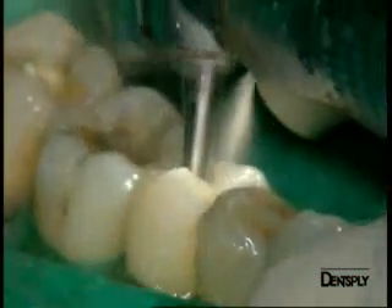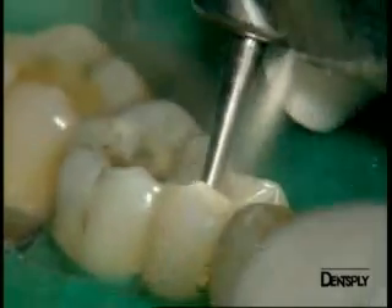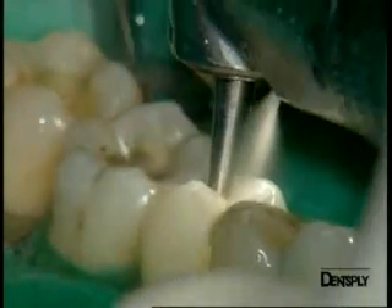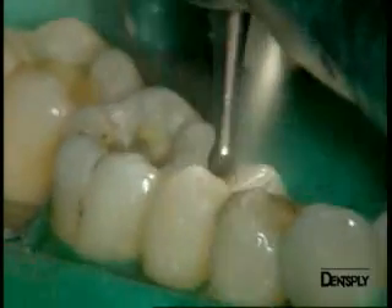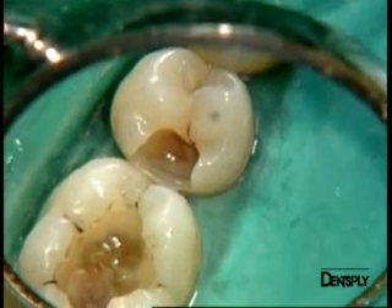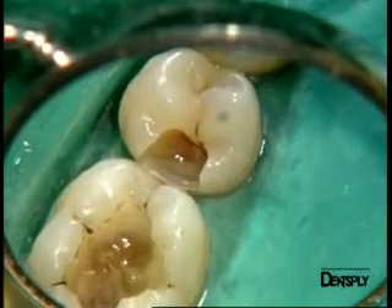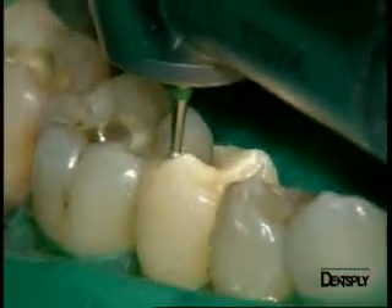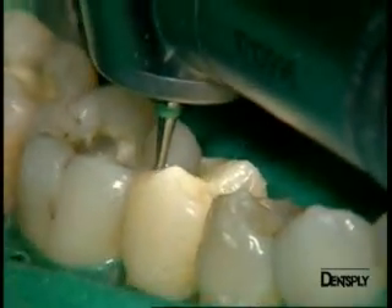We select a round burr with a larger diameter to remove the caries from the premolar. We work very carefully due to the proximity of the pulp chamber, as shown on X-ray. Here you see the brown discolored secondary dentine of the cavity. We now smooth the edges of the cervical floor of the cavity. The cavity is quite a large one, but we could preserve the natural cusps.